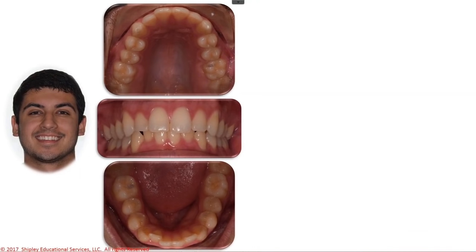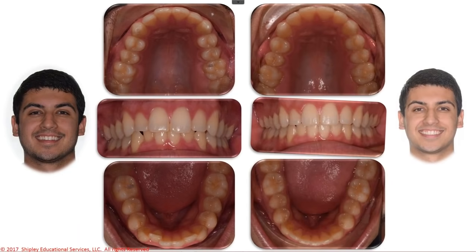This patient was interesting because he works out of the country, and so he could come in and see me on a limited basis, so I wanted to make sure we got good tracking. So he decided he wanted to try the V Pro 5. So you can see that some moderately lingualized upper right incisors and then the ectopic lingual lower incisors. Here we are when we're done.